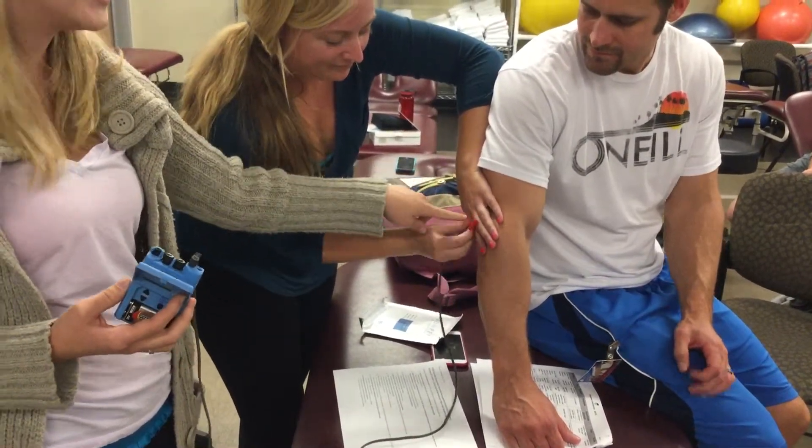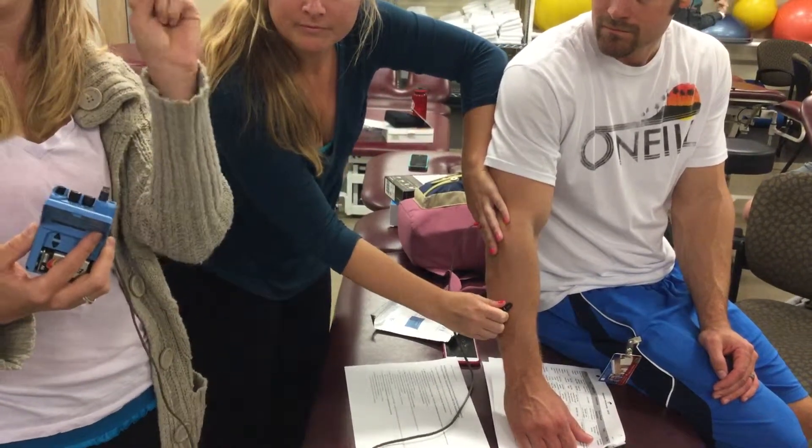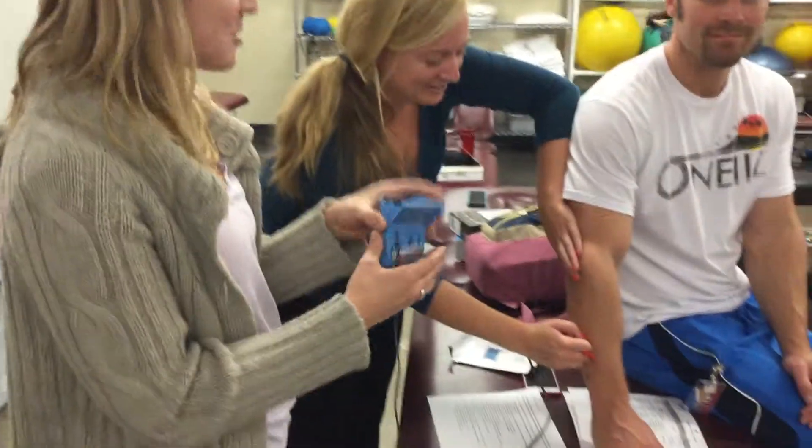You're going to do the electrode attached to these — red is positive and black is negative. For dexamethasone, which is negative, you put the black on that pad and the red on the other one.